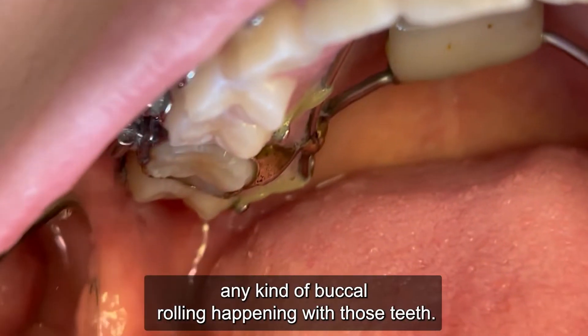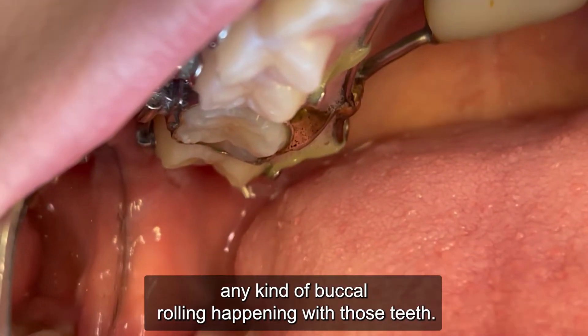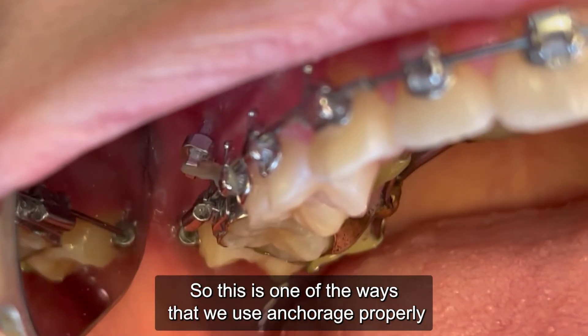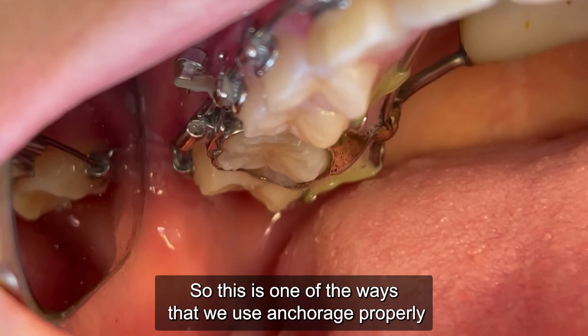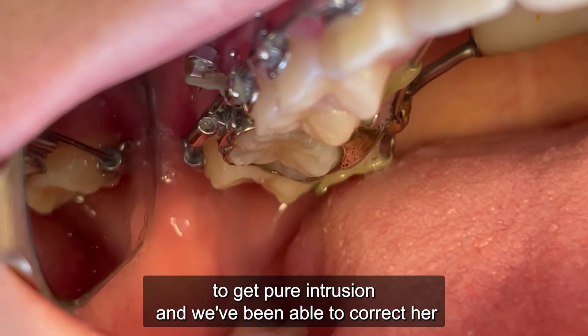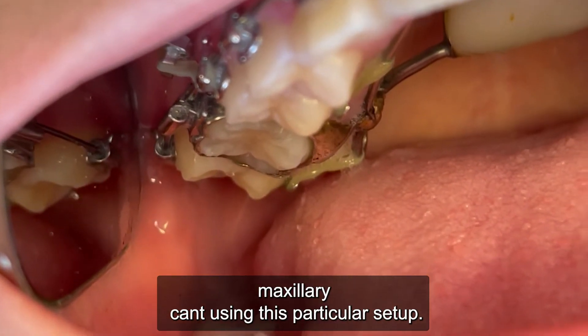So as we are intruding, we're not getting any buccal rolling happening with those teeth as we look down the occlusal plane. This is one of the ways that we use anchorage properly to get pure intrusion, and we've been able to correct her maxillary cant using this particular setup.